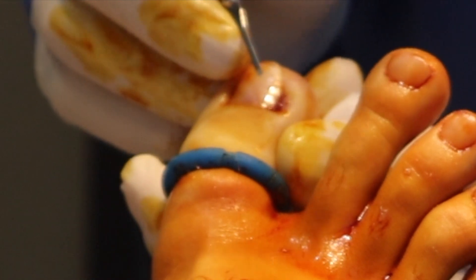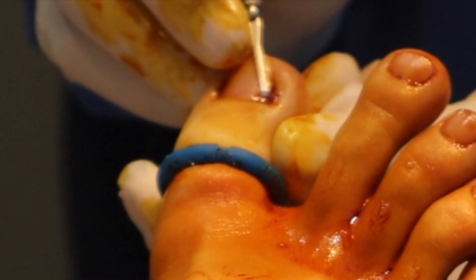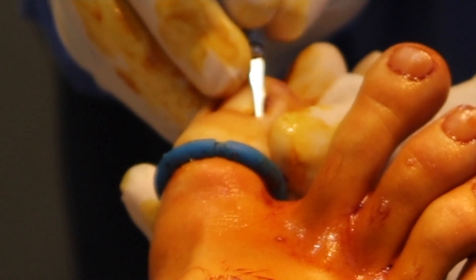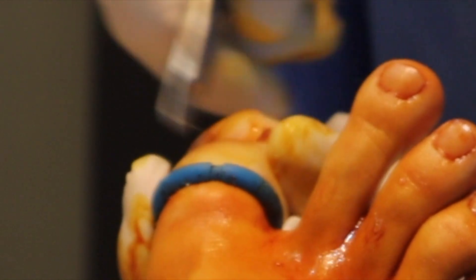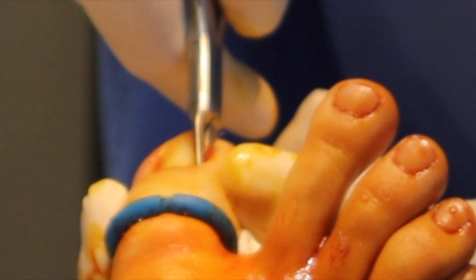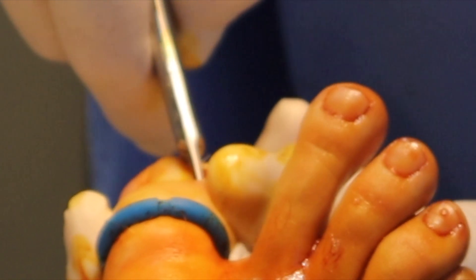Okay, we'll start with the right one. I'm just going to use a number 61 to move the nail away from any attachment to the cuticle, and then I'm going to cut along that border with an English anvil nipper all the way down underneath the cuticle to the root, or what we call the matrix.